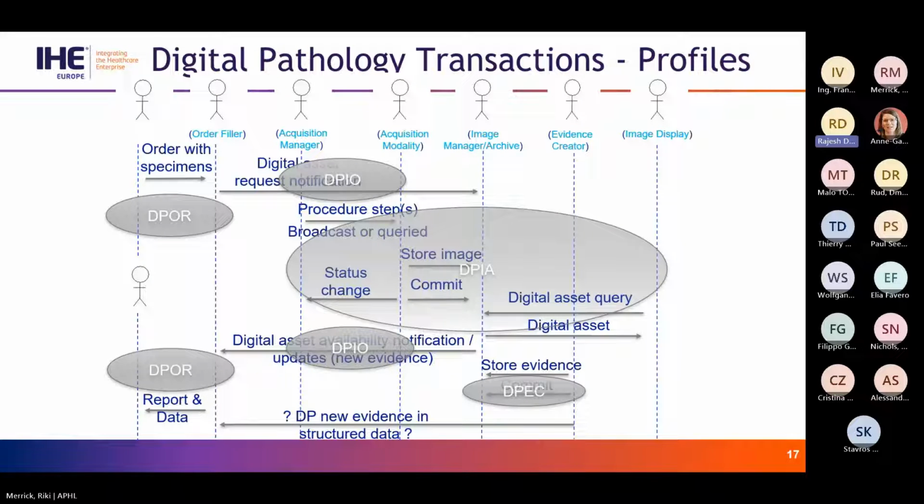So these are how all the different profiles were envisioned to cover the different spectrum of transactions that need to occur between these actors communicating with one another. The first is the Digital Pathology Image Acquisition Profile, or DPIA, which I'll go into in more detail next.